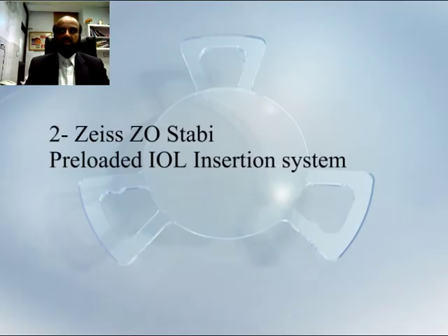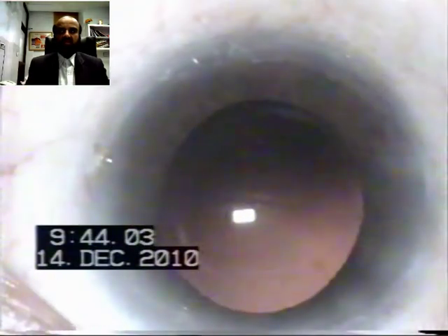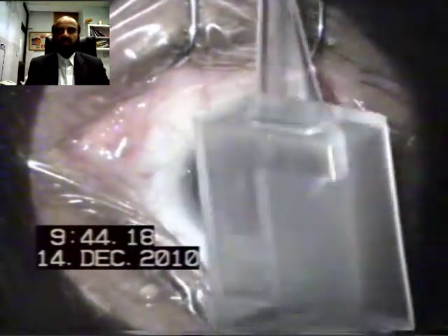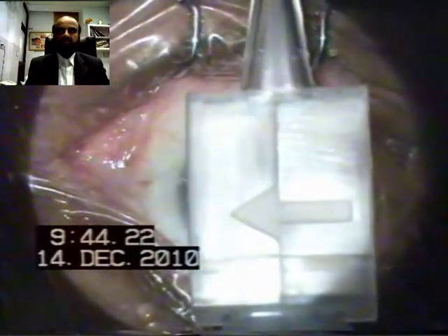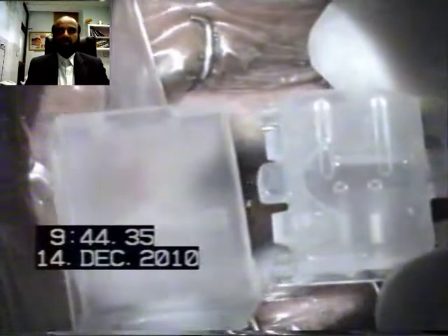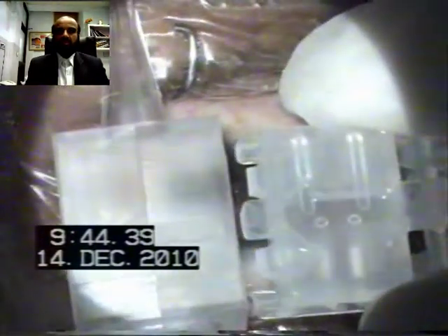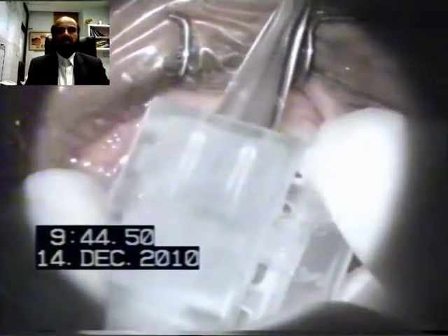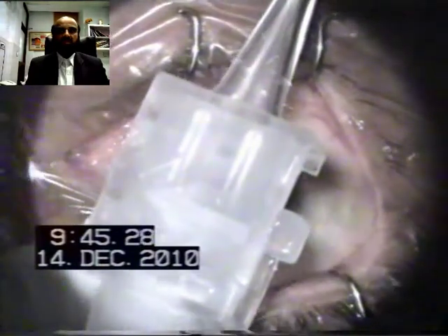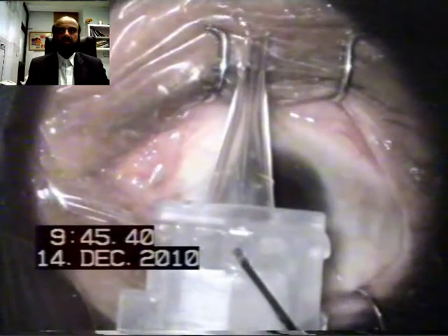The IOL unfolds and is injected very smoothly into the bag. The second video clip is about the Zeiss ZO Stabia IOL injection system. After routine phaco, the plunger is taken and the cartridge is parked separately. Both arrows on the cartridge and on the plunger are matched with each other, and the plunger is gently pushed into the cartridge. Once it locks itself, the lock is broken away and rotated.